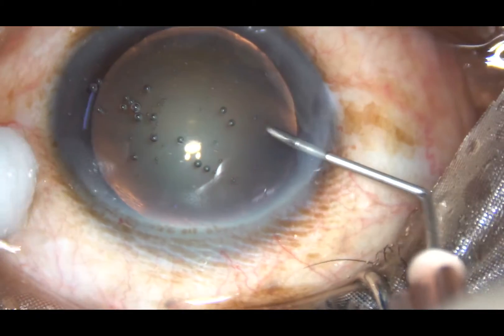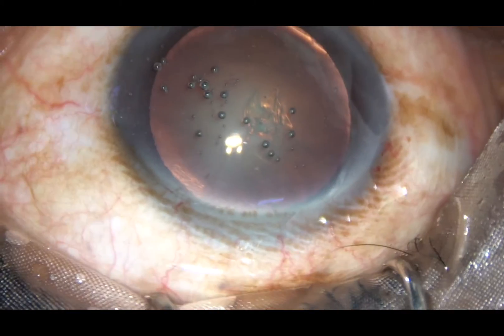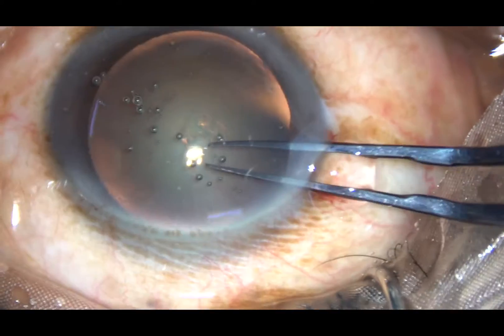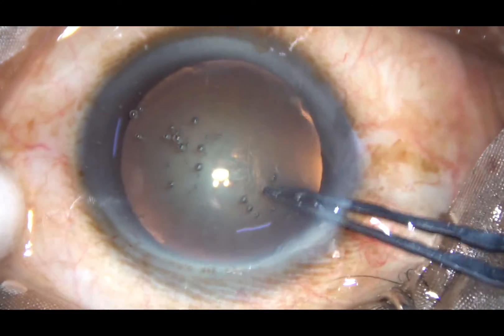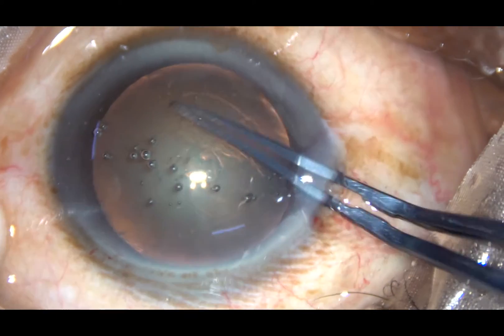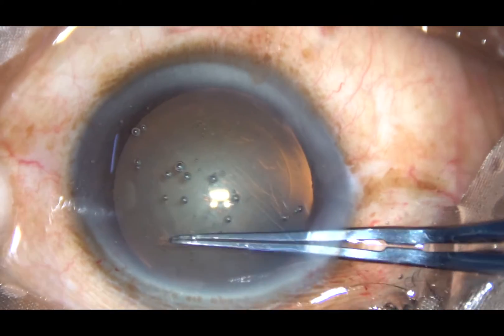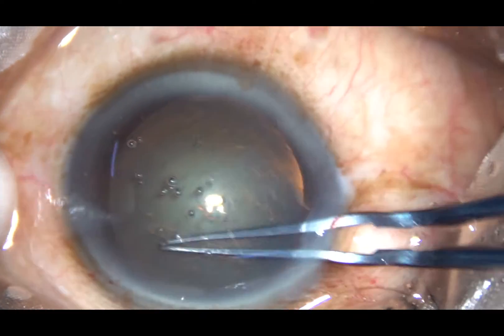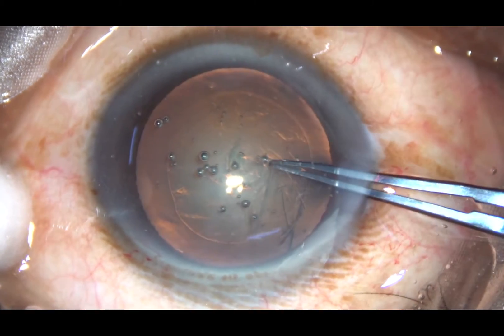The anterior capsule is incised with a 26-gauge cystotome needle and a large capsular flap is raised. Now I take a Utrata forceps, hold this capsular tag, go anticlockwise, and I make a rhexis — a continuous curvilinear capsulorhexis of the right size.